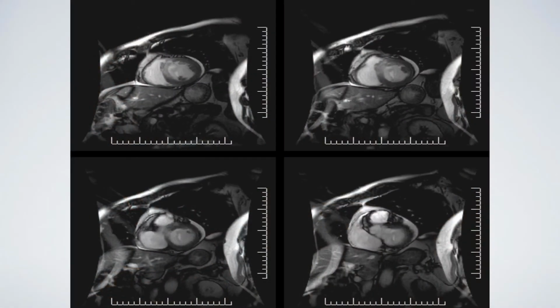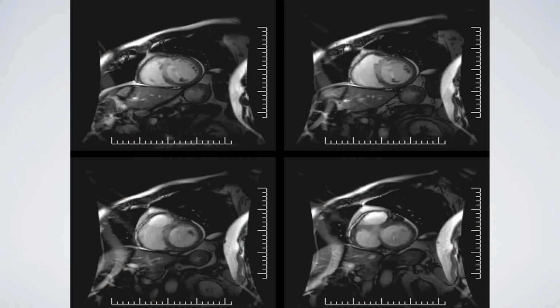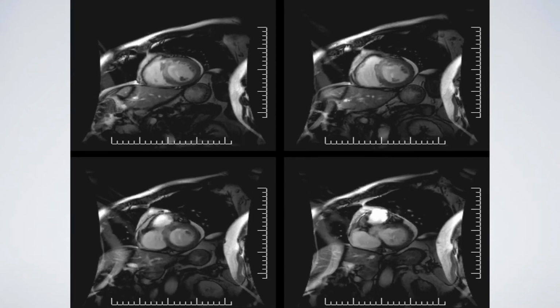And again, for those of you who don't do cardiac MRI, if we look on the top left one and at that circle of muscle, towards the top left you can see that it becomes white, and that is the MRI signal telling us that there's infarct in that area. If you look closely, whilst the other bits of the circular muscle are contracting inwards, that white area is barely moving. And so that is infarcted muscle that we're looking at on MRI.